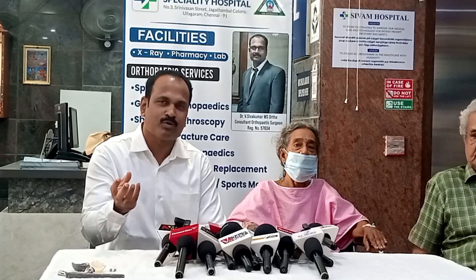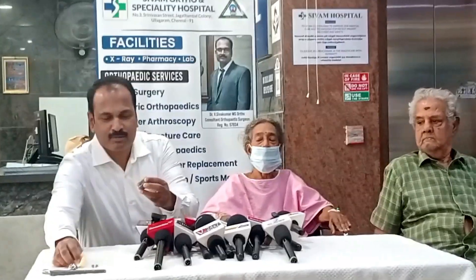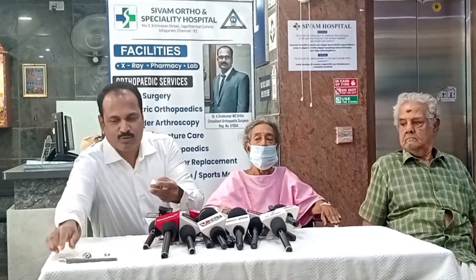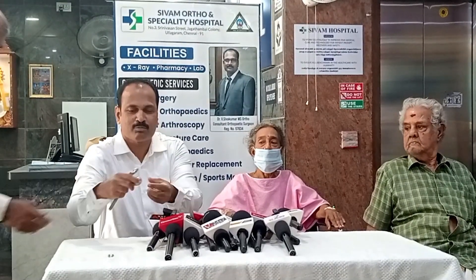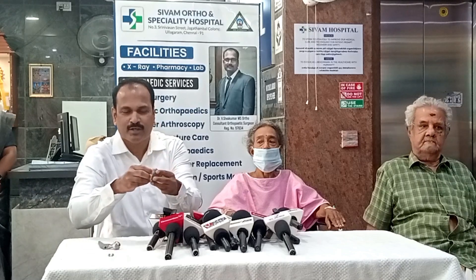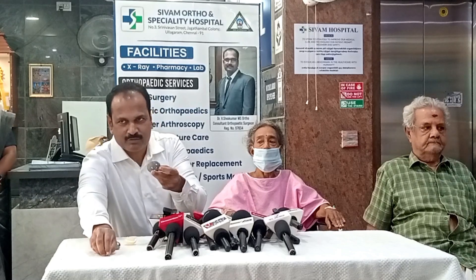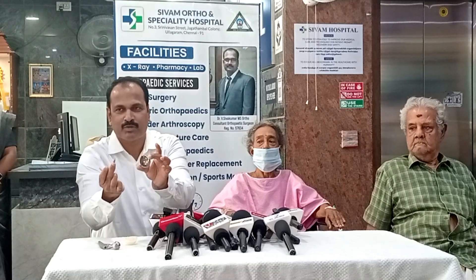The hip replacement involved removal at the neck of femur. This is the cup, this is the liner and poly liner, this is the femoral head portion, this is a cemented stem, and this is a press fit cup. This screw is used to fix it.